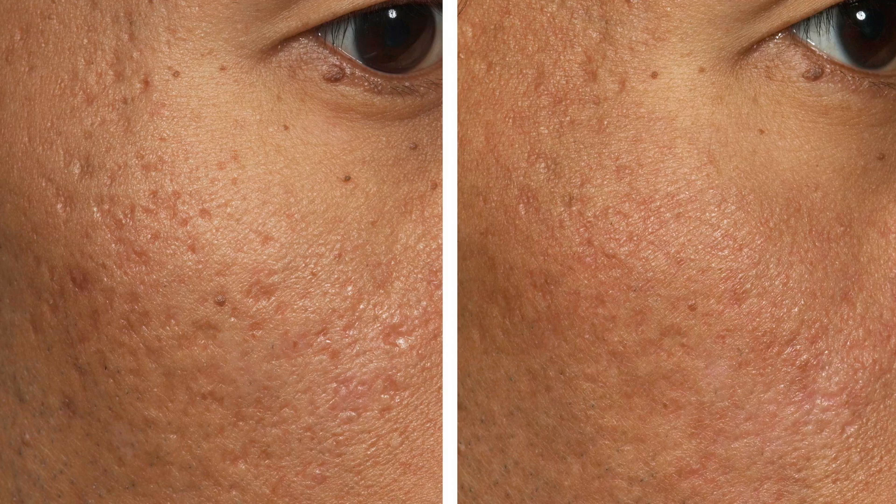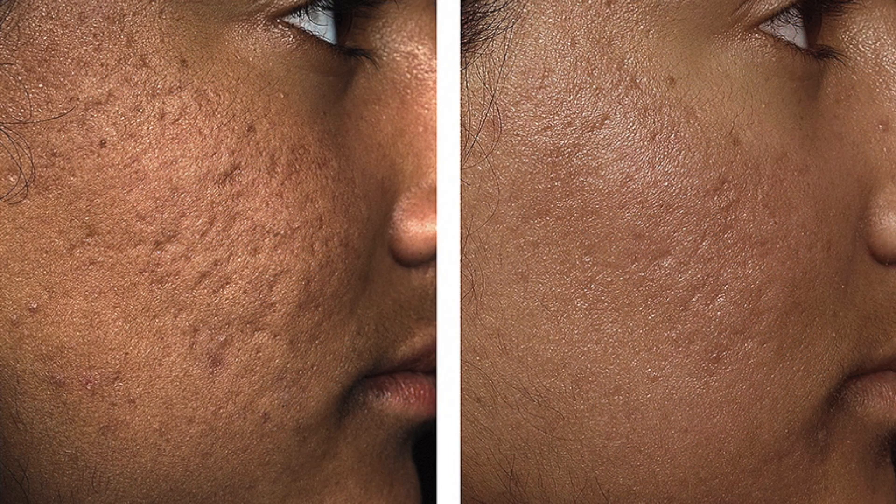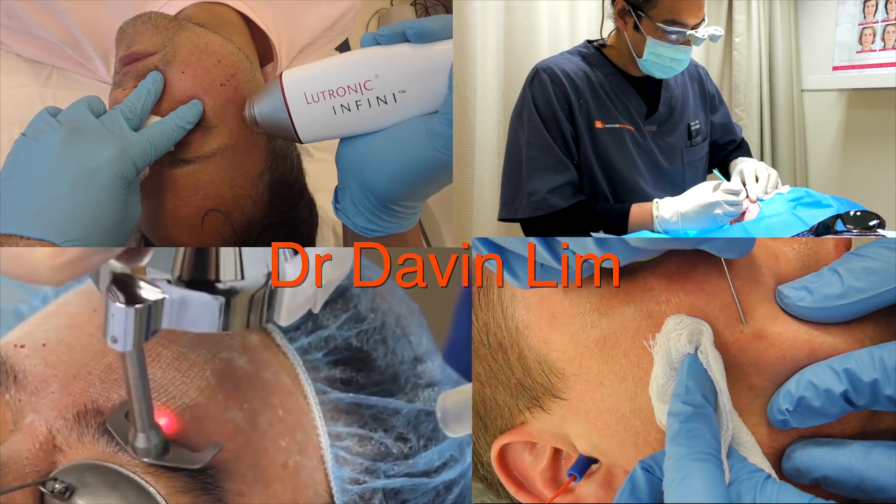So, what are the before and afters like following all of these treatments? This is a basic before and after following three to four treatments of CO2 laser. These are classic examples and my favorite — CO2 laser resurfacing before and after. These are realistic expectations following multiple treatments of CO2. This is with the E-matrix as part of my RF program, treating early acne scars and active acne.